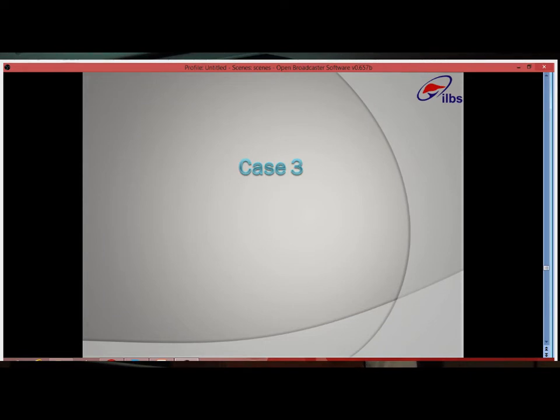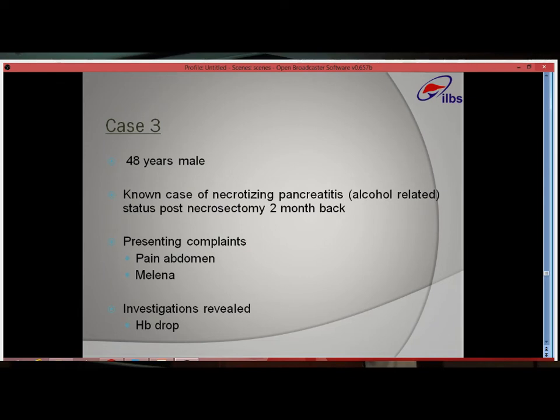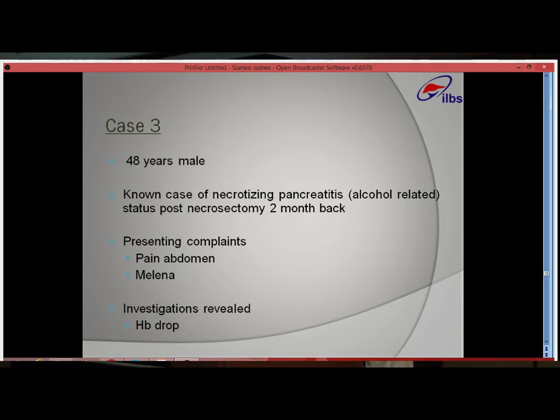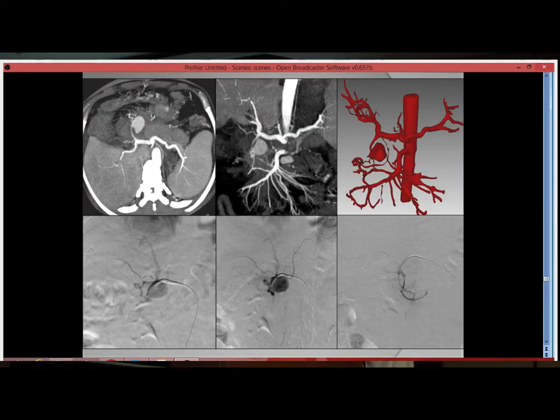Case 3 is a 48-year-old male, a known case of necrotizing pancreatitis, alcohol-related, who had undergone necrosectomy 2 months back. This time the patient presented with abdominal pain and melena and was found to have a drop in hemoglobin, so active bleed was suspected. CT angiography was performed and showed a pseudoaneurysm around the head of the pancreas, arising from the pancreaticoduodenal arcade. In this case the supplying vessels are both from the superior pancreaticoduodenal and the inferior pancreaticoduodenal arteries.